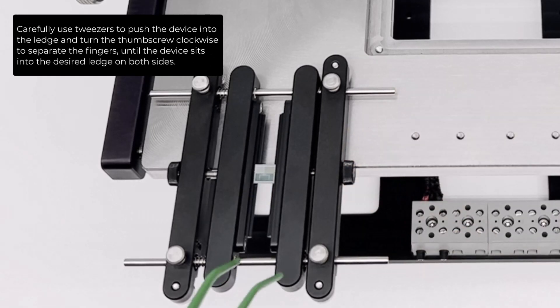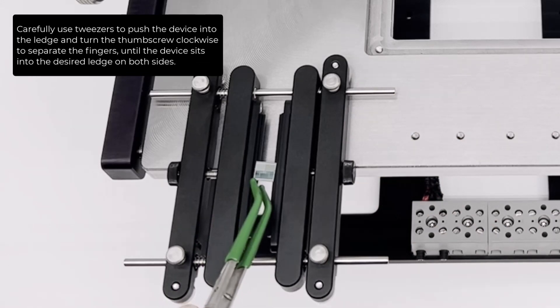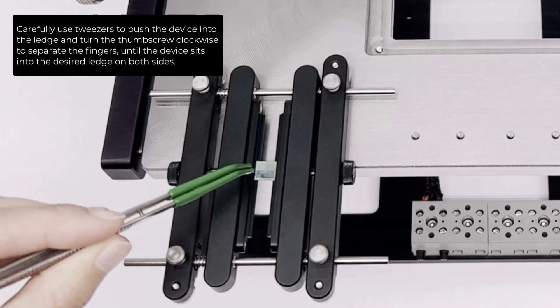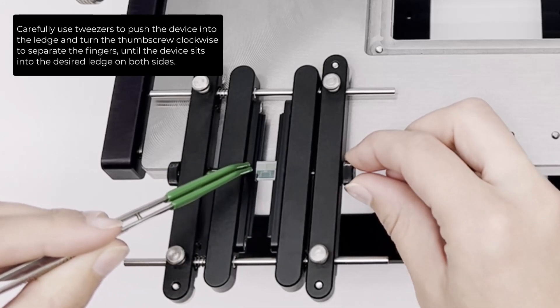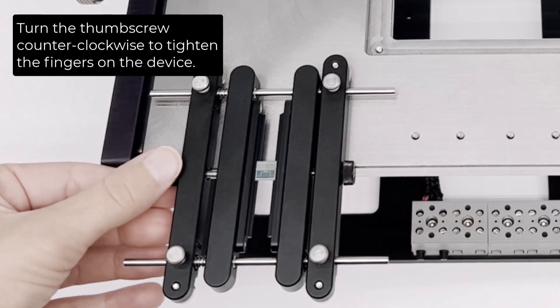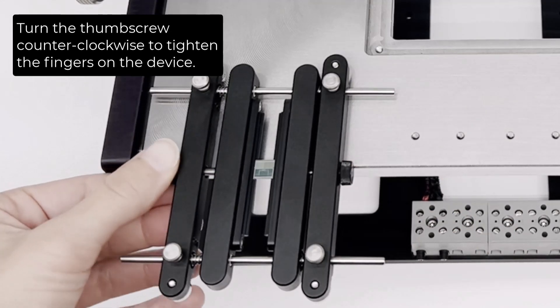Turn the thumb screw counterclockwise to tighten the fingers on the ledge. Carefully use tweezers to push the device into the ledge and turn the thumb screw clockwise until the device sits into the desired ledge on both sides. Turn the thumb screw counterclockwise to tighten the fingers on the device.